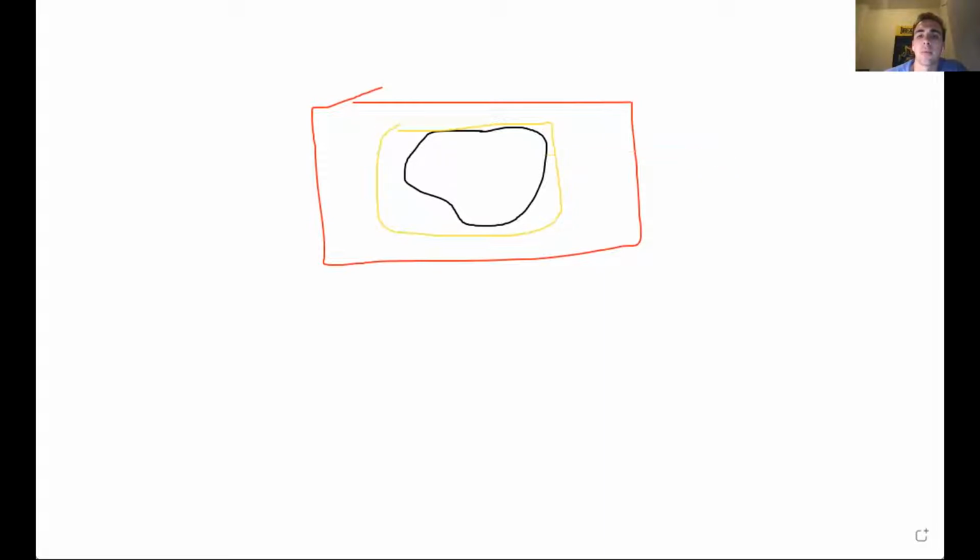What we're doing instead is taking each image and calculating summary statistics. So we're looking at the size, the shape, the coarseness, other second-order features about its 3D structure, and using those as individual features in our machine learning algorithm instead. We're trying to be smarter about what features we're engineering and using. You don't just want to throw an image into a CNN because it's pretty expensive to do that.